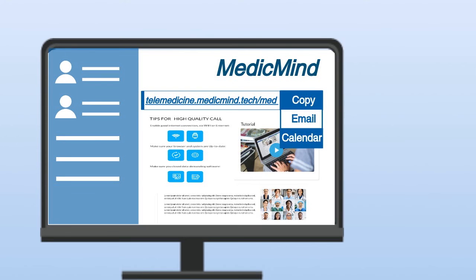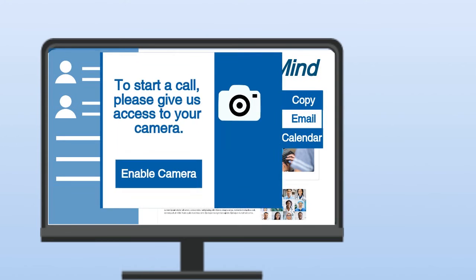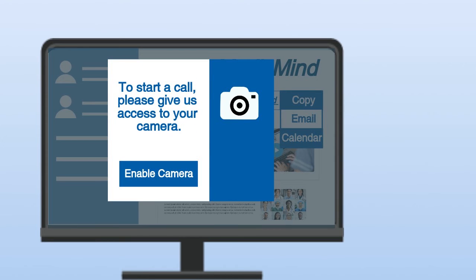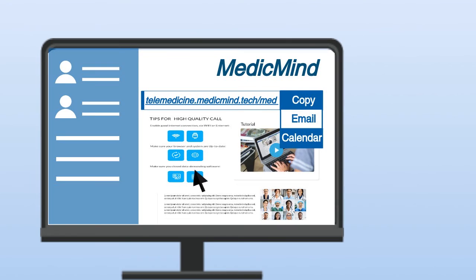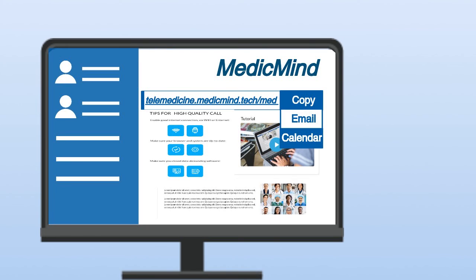To begin a telemedicine call, permission to access your camera and microphone will be requested. You can then send your personalized invitation link to your patients, enabling them to check into your meeting room on MedicMind. You can copy the link and paste it in an email to your patient, or click on invite and email it with your email client.